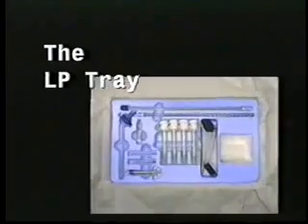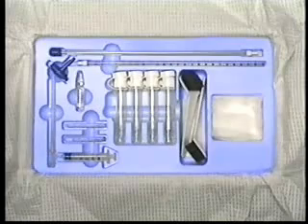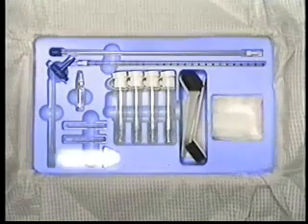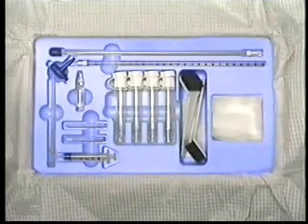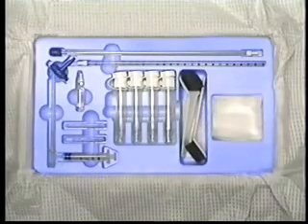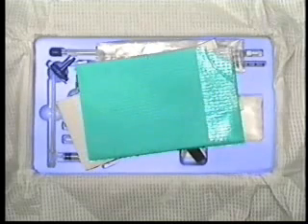There will be some differences among procedure trays, depending on the manufacturer. A typical tray contains a 2-piece manometer, a 21-gauge deep infiltration needle, an ampule containing about 2 milliliters of 1% lidocaine hydrochloride, a 3 cc plastic syringe, a 20-gauge spinal needle with stylet, and a 25-gauge skin infiltration needle, 4 numbered sample vials, a bandage. In this kit, it is beneath 2 prepping applicators, gauze, extension tubing, a cover, a fenestrated drape, and betadine.